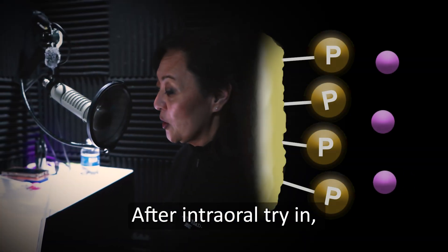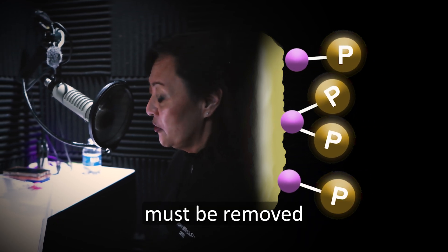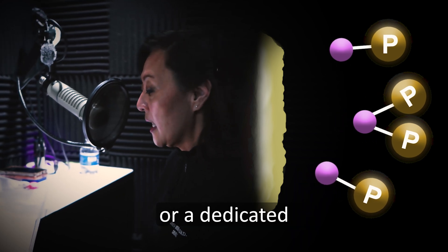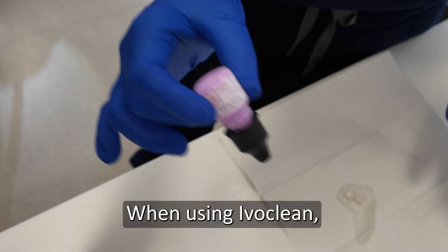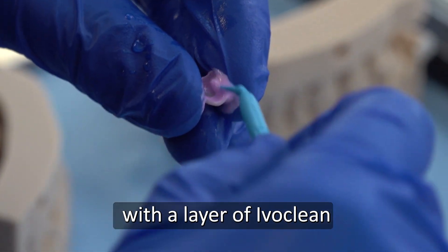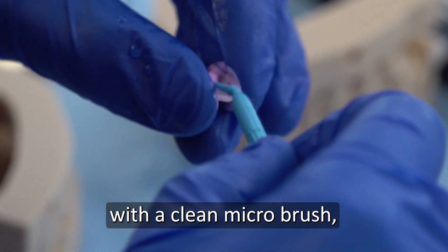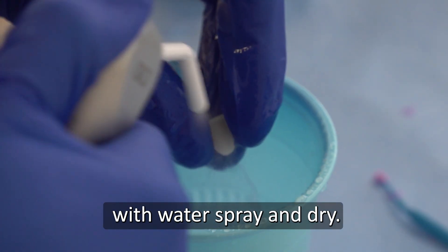After intraoral try-in, the salivary phosphate contaminants must be removed by either chair-side air particle abrasion or a dedicated zirconia cleaning agent like Ivaclean. When using Ivaclean, first shake the bottle before use. Cover the intaglio surface with a layer of Ivaclean and allow 20 seconds for the cleaning action to take effect by scrubbing it in with a clean microbrush. Then thoroughly rinse with water spray and dry.